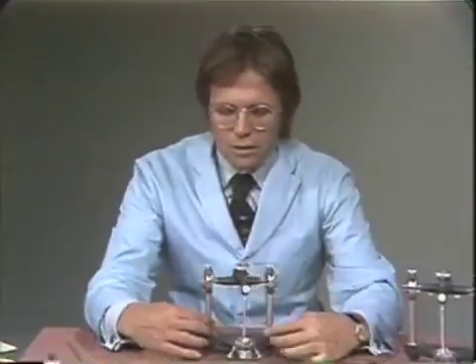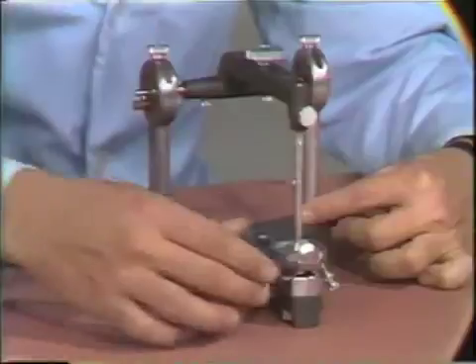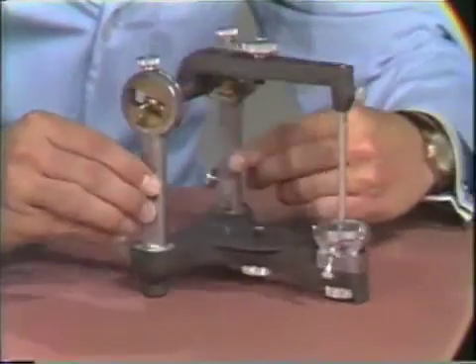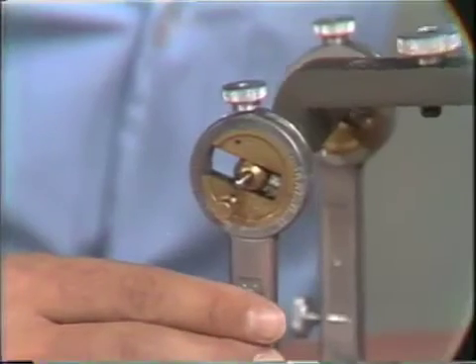Before mounting casts on the Hanna articulator, particularly the H2 model articulator with the protrusive-retrusive adjustment, we must consider the alignment of the articulator. Cases done previously may leave the articulator out of alignment. We check for alignment by positioning the vertical axis at zero, placing the incisal guide table at its zero reading, then making sure the centric lock screw is loosened, providing freedom in the articulator.